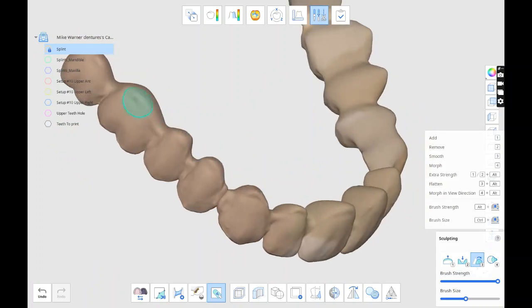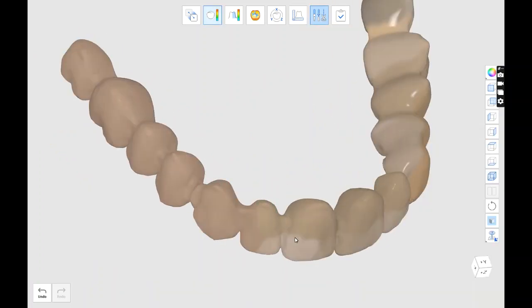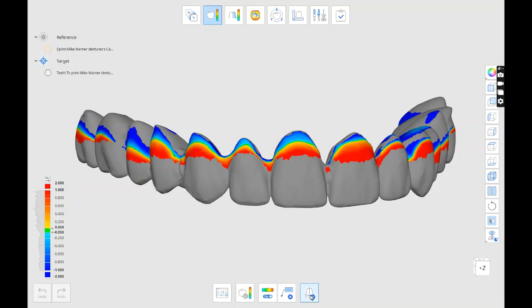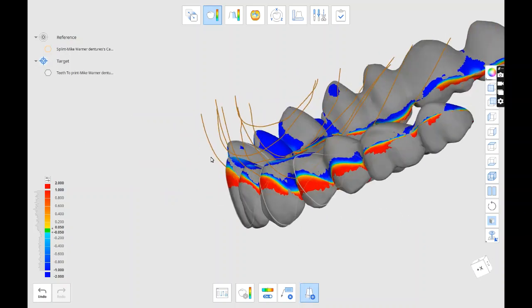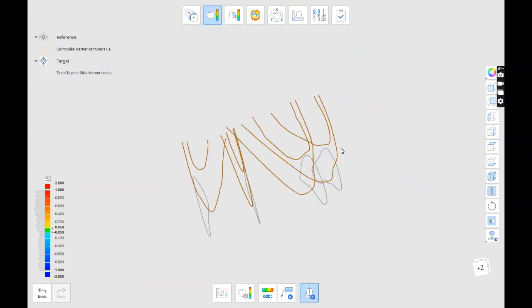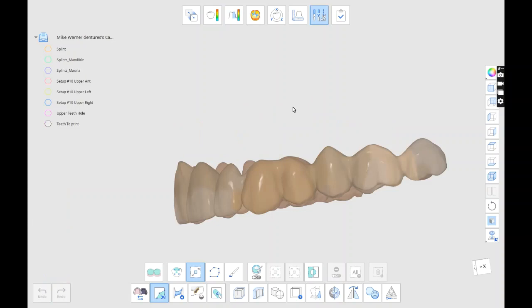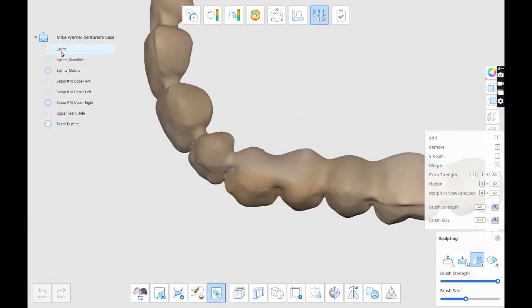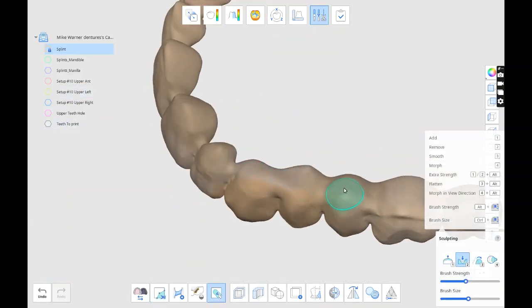So if you look in the upper left-hand corner of the splint, it's locked. That way when I adjust, only the teeth are going to be adjusted, not the gums. We don't want the intaglio of the gums to be adjusted.